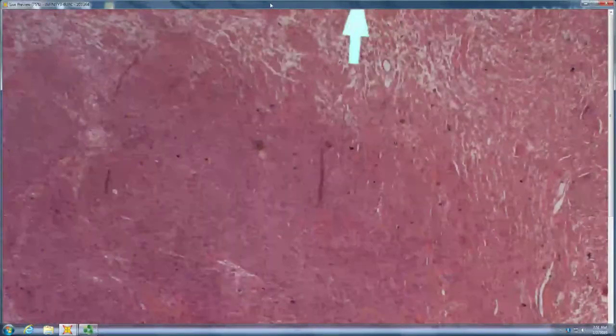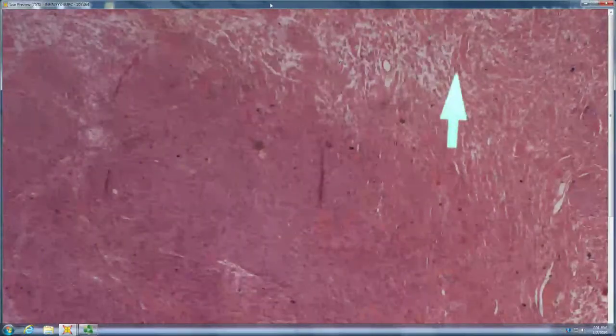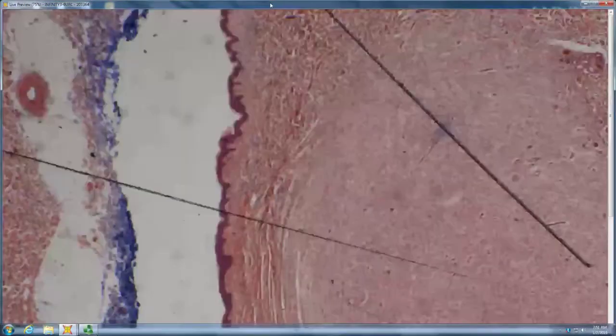There are some still fascicles within it. You might consider an intraneural neurofibroma if you wanted to tell the difference. You get a neurofilament stain. In the schwannoma, you have no neurofilaments, maybe a nerve trunk squashed on one side, and in the neurofibroma, they're spread throughout.